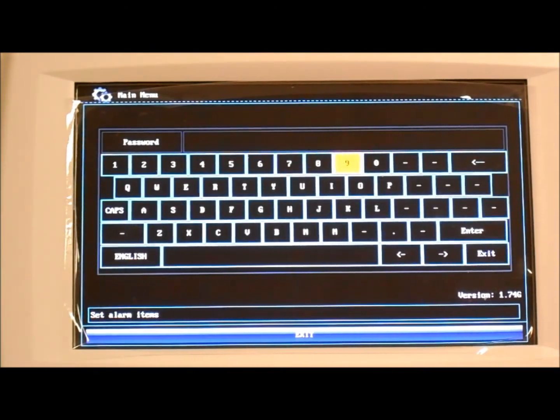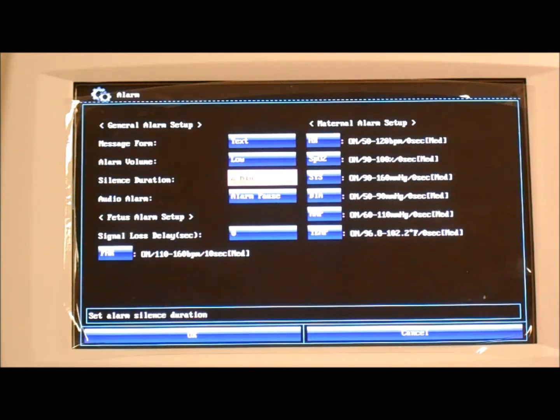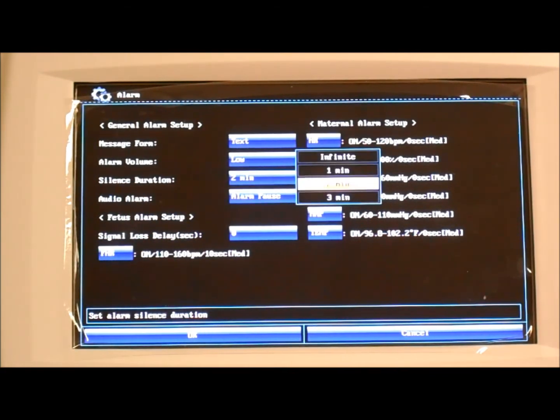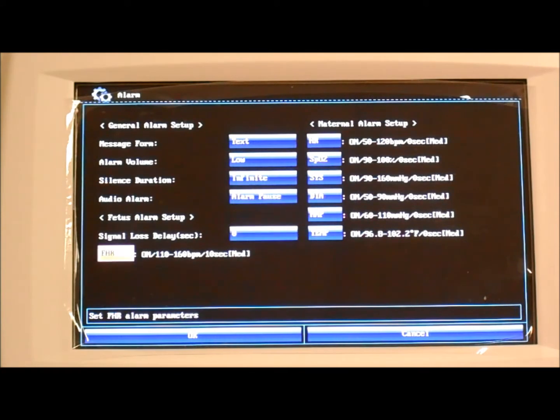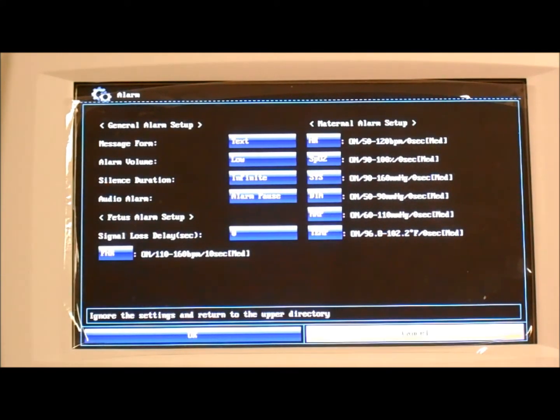Your alarm, 9999. So again, here we can adjust your ranges. And the other setting of interest that I wanted to point out, it's the alarm pause setting or silence duration. If we set it to 1 minute, 2 or 3 minutes, it'll only be muted for those specific reference points. If you set it to infinite, it'll be an infinite or a long-term mute. Okay, so alarm, we can adjust all your alarm ranges for all your parameters.